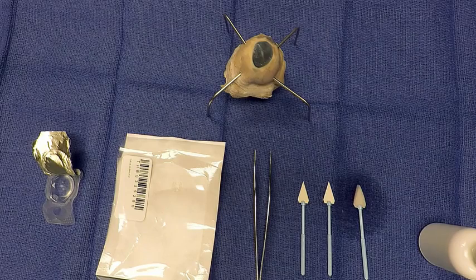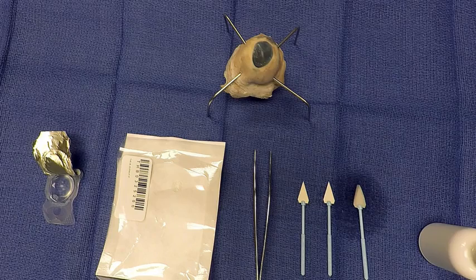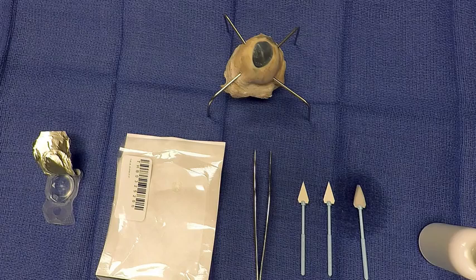Today we are performing a Pig Eye wet lab using the Dual Air 10mm Eclipse Amniotic Membrane Disc from Opthologics. We will be demonstrating the application process of the amniotic membrane for ophthalmic uses on the ocular surface.